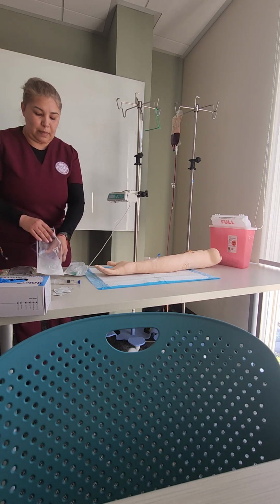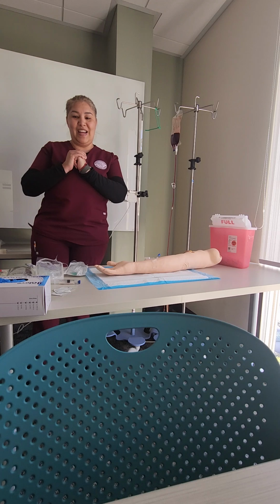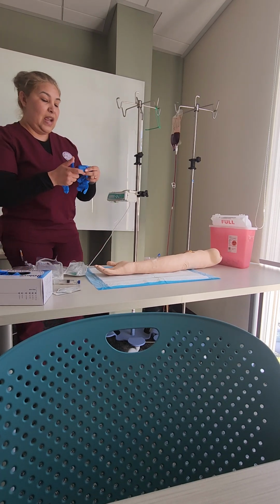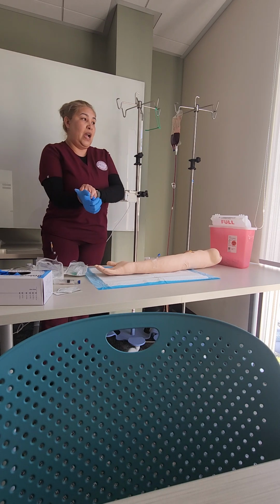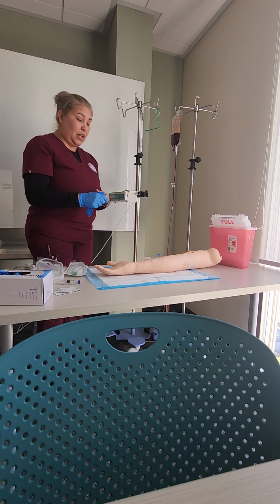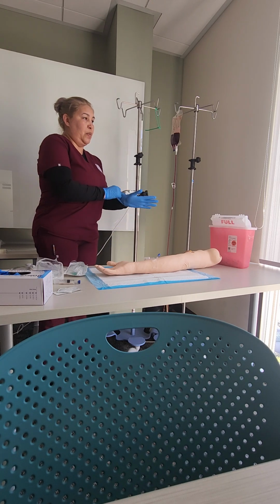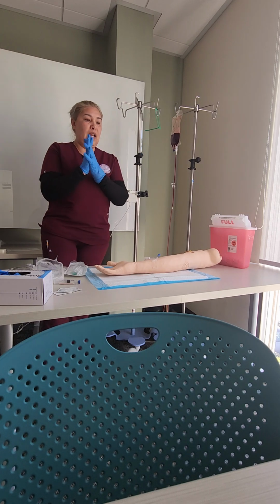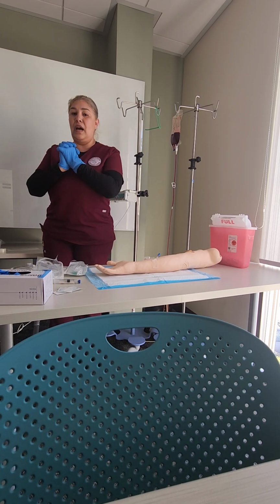So what I will do now is I'm going to perform hand hygiene. I'm going to put on my gloves because I want to have my gloves on. And I want to ask my patient if it's okay if I give the hydration solution and the antibiotics. My patient has agreed. I have checked that I have the right patient. I have checked that I have the right drug. I have checked that I have the right reason for giving this patient the fluids and antibiotics.